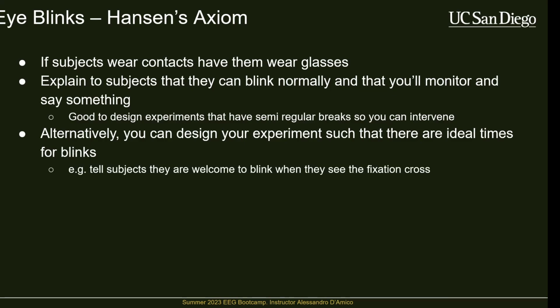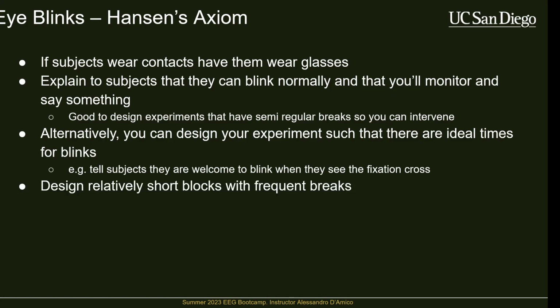But this is a very common method, so whenever you see a fixation cross, you're allowed to blink. This is a strategy we use for kids sometimes that cannot hold their blinks. We'll say, okay, you're blinking a lot, that's okay. Just make sure you're only blinking when you see the plus sign on the screen, and really try not to blink when you're saying a word. We reserve this for special scenarios because again, it's adding additional task constraints.